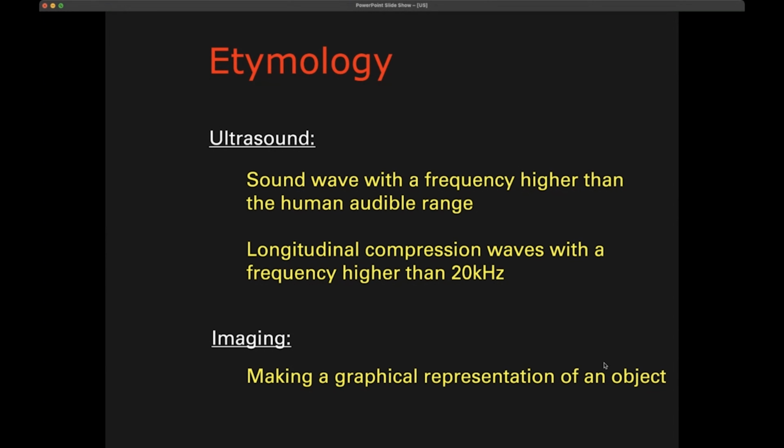And we're going to use these ultrasound waves, properties of wave propagation, and especially wave reflection, in order to do imaging, so to make a graphical representation of the object.